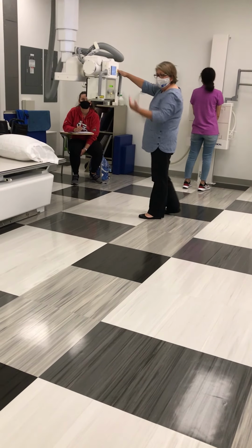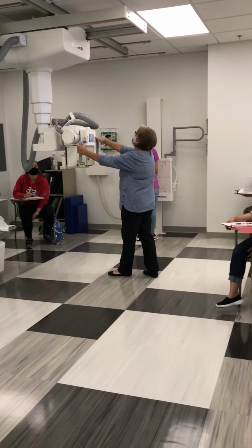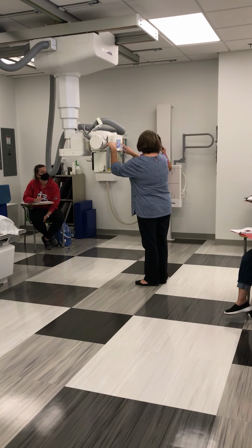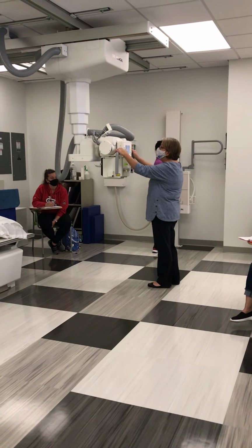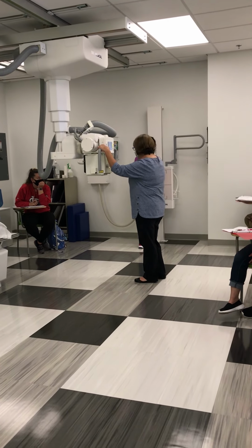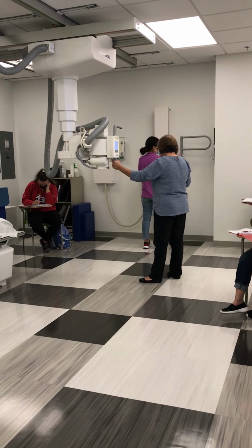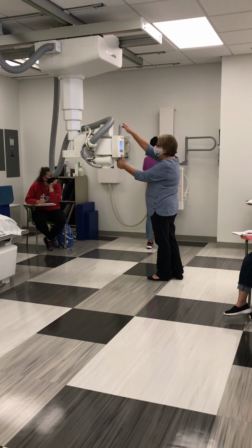And remember last week I talked about having the tube in transverse detent to the table. This week, for the PA and lateral chest, since our patient's at the wall stand, I'm putting my tube in transverse detent so that it's centered to the wall bucky. I'm using the wall bucky, so my central ray needs to be directed toward the wall bucky, wall stand. So I'm moving my tube so that it's horizontal, have a 90-degree readout.